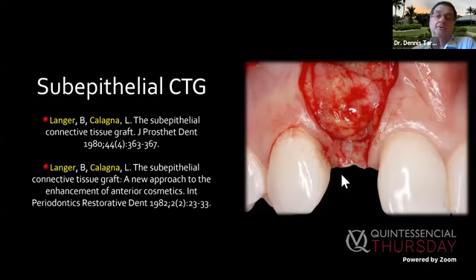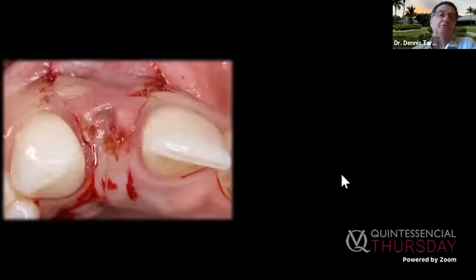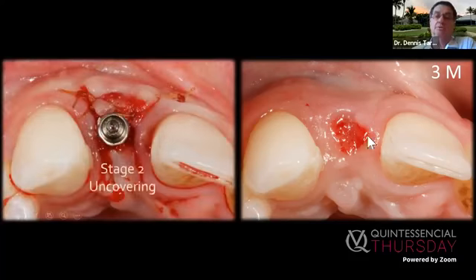I'm going to take a thick connective tissue graft, as you see here, as thick as I can get. I'm going to put that underneath. I need soft tissue here. She has bone on the implant. I could have built some bone up too, but I need tissue because I've got to create a new emergence profile. Place the flap. There you see that, in fact, we got some swelling, and the ovate pontic, which was relieved, now is touching the tissue and creating a little indentation.